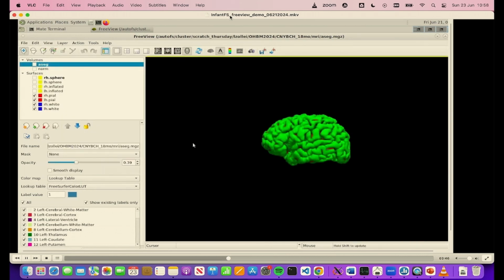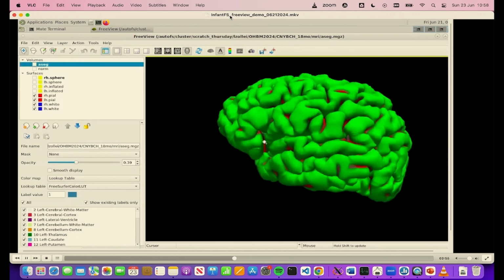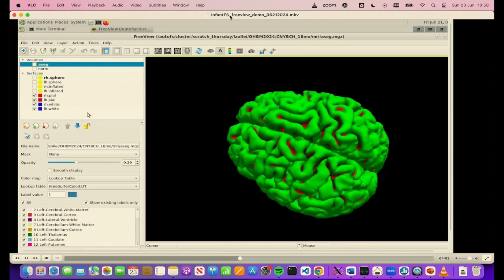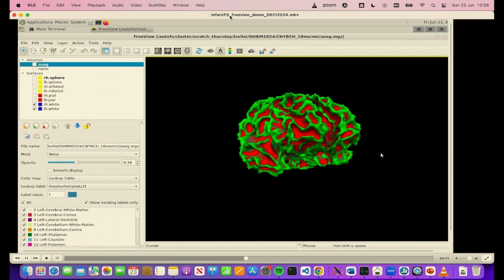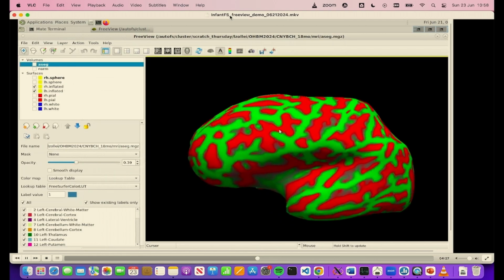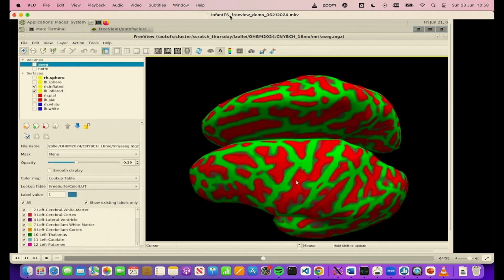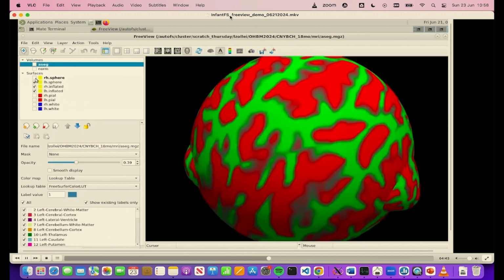So now we switch to the 3D volumetric representation. Here we have the pial. So I have highlighted both the pial and white matter surfaces, but given that the pial surfaces are over the white matter, initially you could only see the pial surface representation. Now we unclick those, so you see only the white matter surfaces. And now I made the inflated surfaces visible, so you can zoom in on some of the features, you can turn them around, you can look at them one by one.